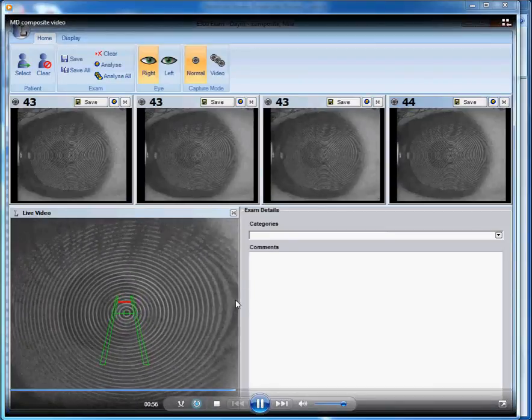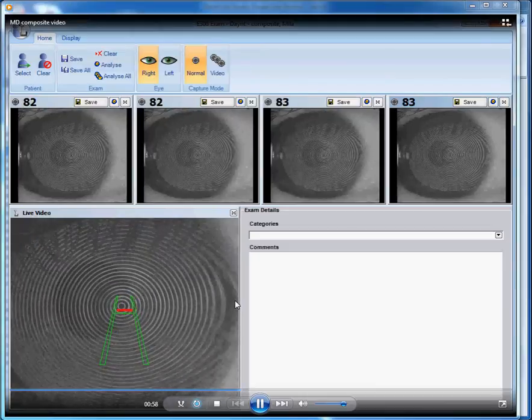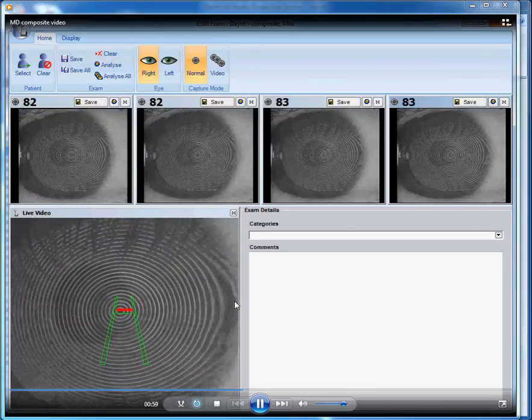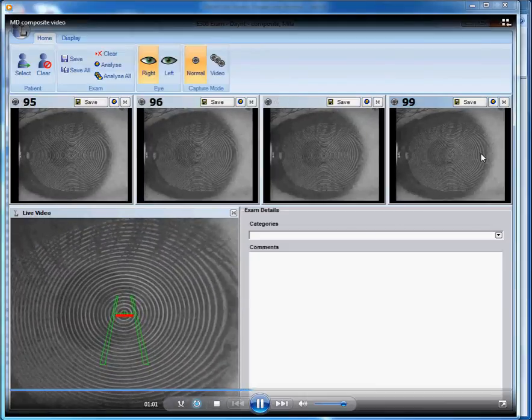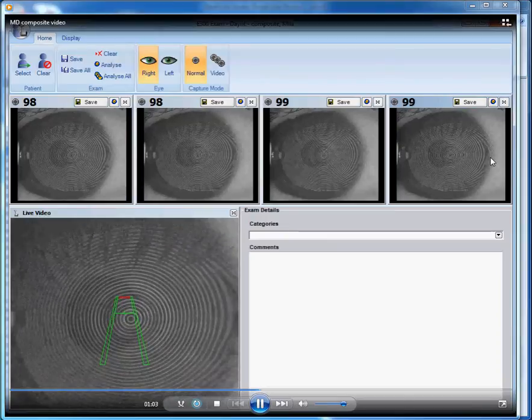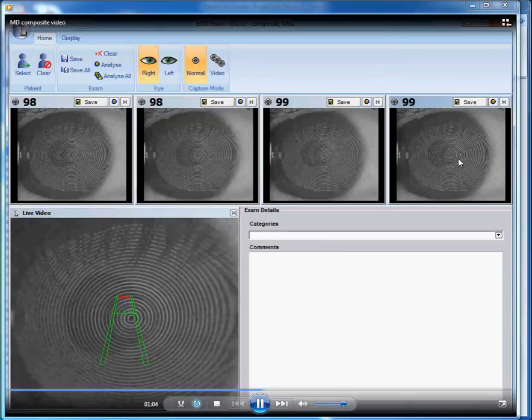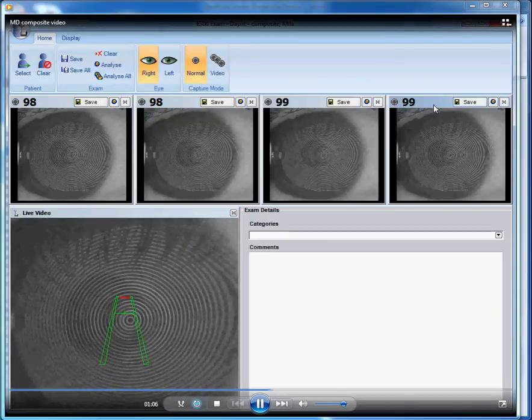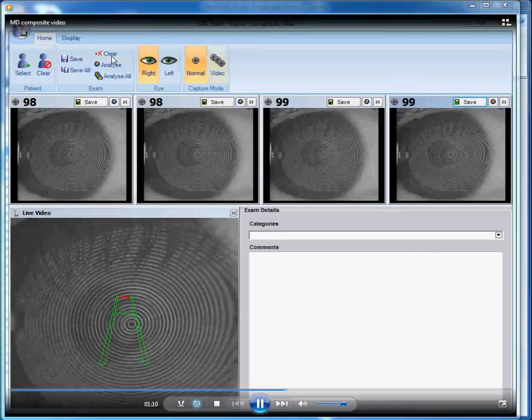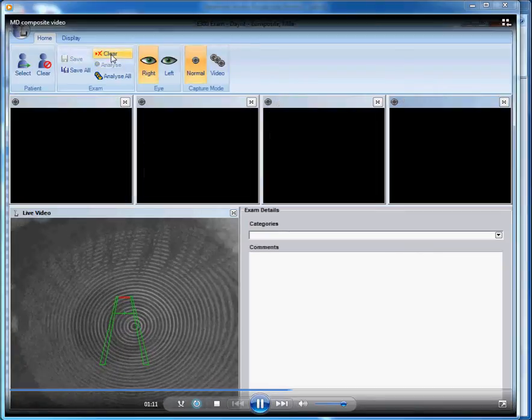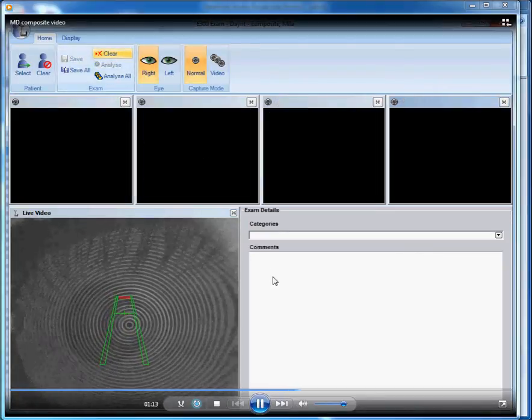We're going to now have the patient look three to five rings temporal and push the placido reflection to the nasal aspect. When we have a 99% or better, we'll click Save, and then again, click Clear Images, and start over and take a fresh image.